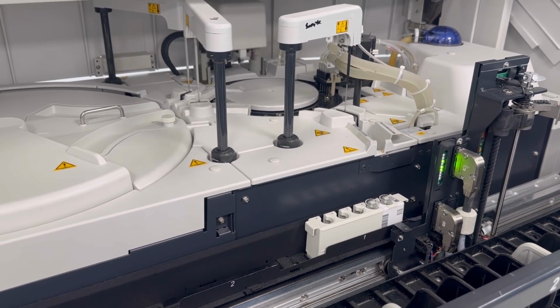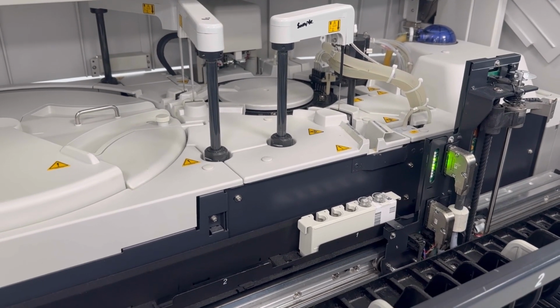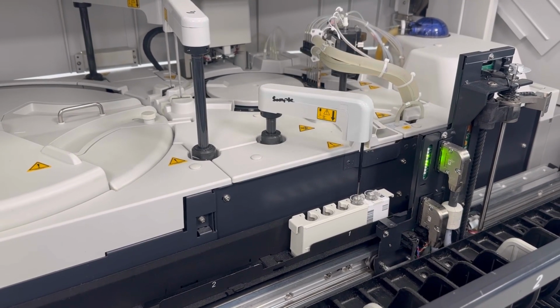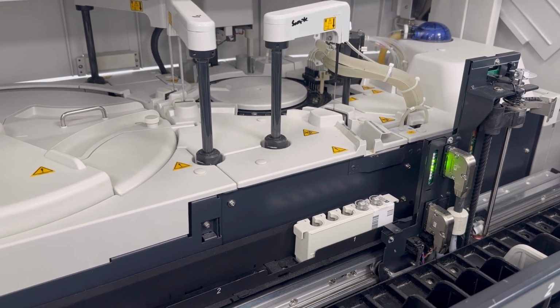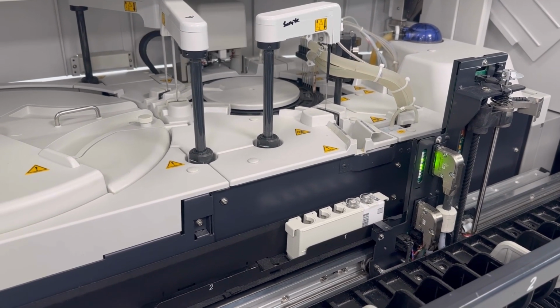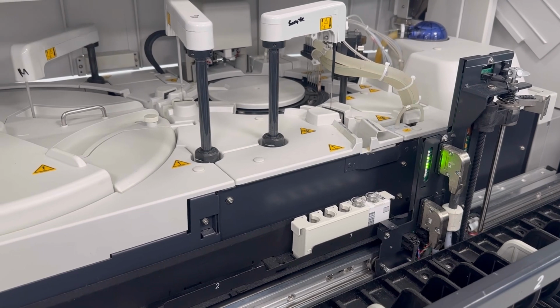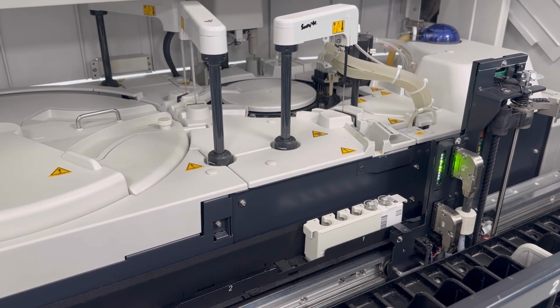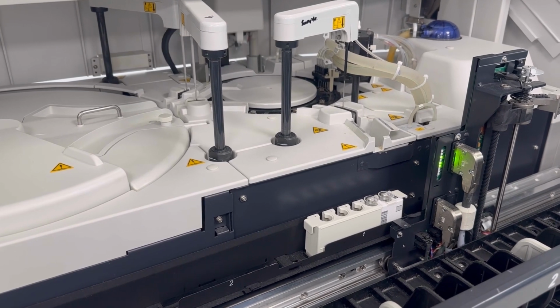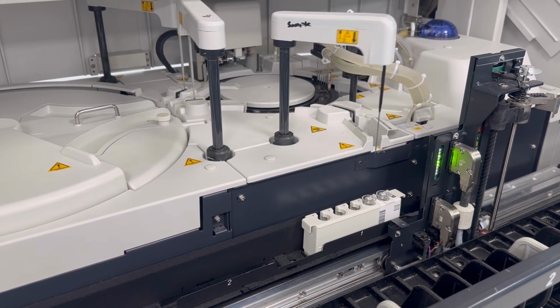So it's better to always check that your serum is clearly visible without any fibrinogen. Otherwise this probe can also get spoiled or destroyed, and the machine can give you a problem if the probe gets harmed, destroyed, or affected by the fibrinogen.